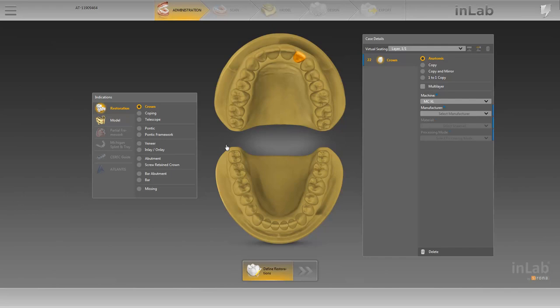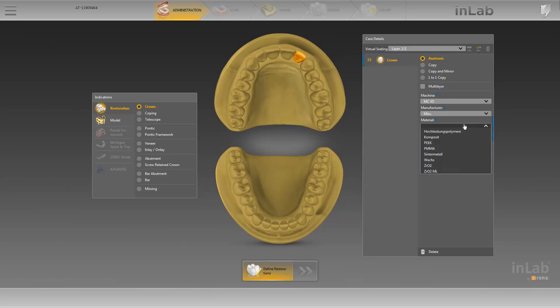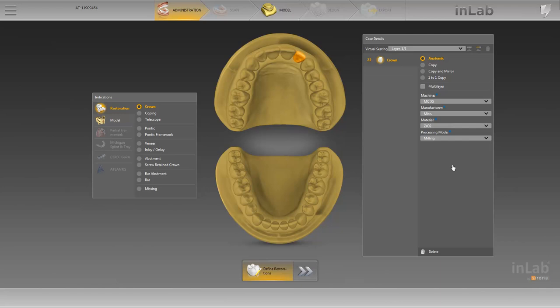After the file has been imported we are automatically moved to the administration phase, where we determine the grinding and milling unit, the material manufacturer, and the material. After we have filled in all required fields, we move to the next available phase.